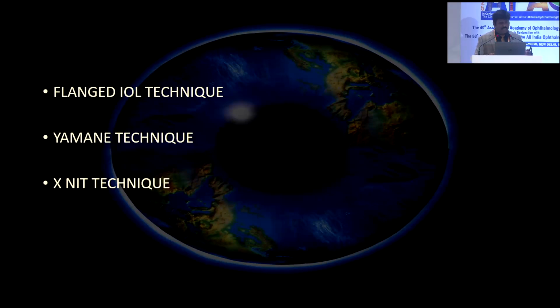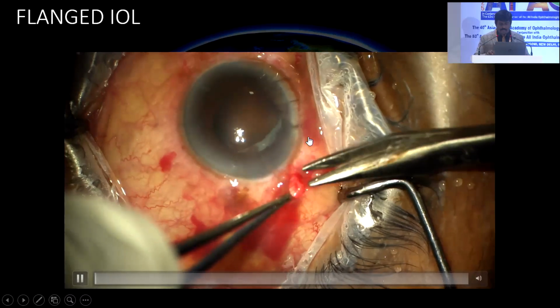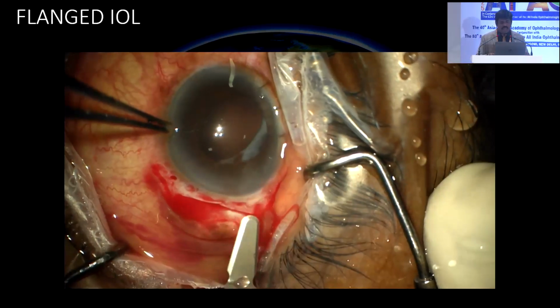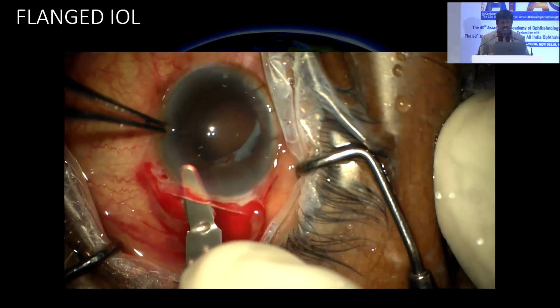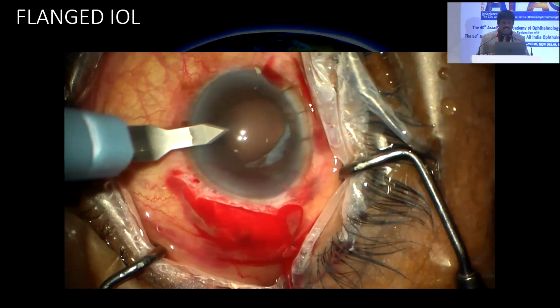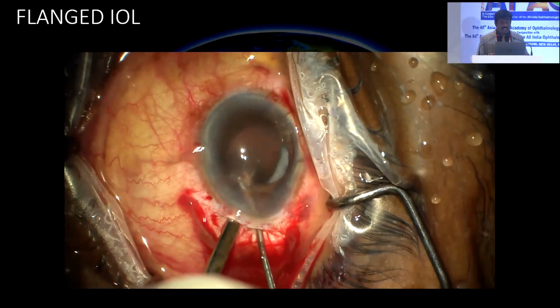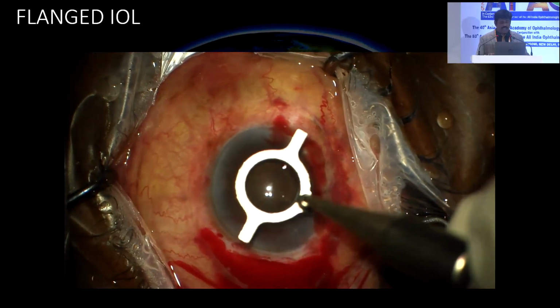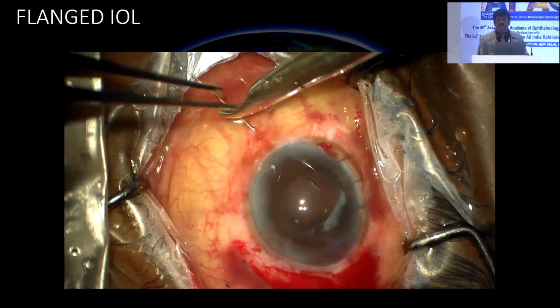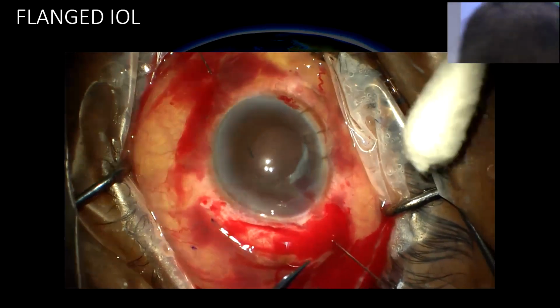The Yamane technique was already shown by my previous speaker. In the flanged IOL technique, the corneoscleral incision is made, and a good pocket is opened up for the IOL entry over there. 2 stab incisions are made on the other side, and a good vitrectomy is done to remove all the vitreous from the anterior chamber. And a needle, which can be a 6-0 Prolene or a 7-0 Prolene, is injected and entered inside the eye on either side.